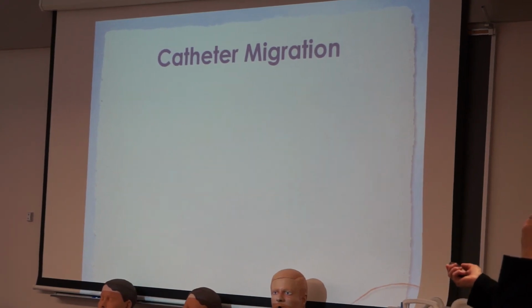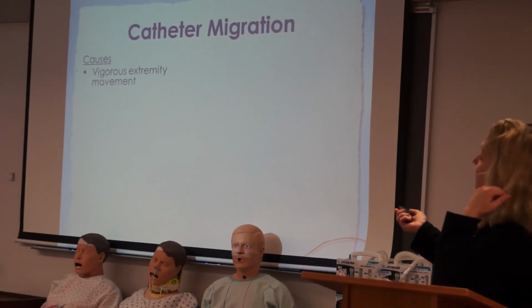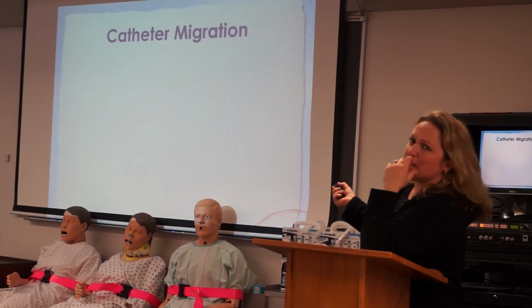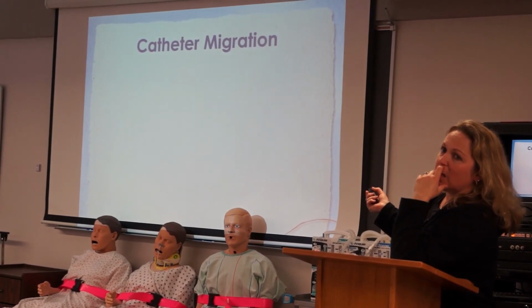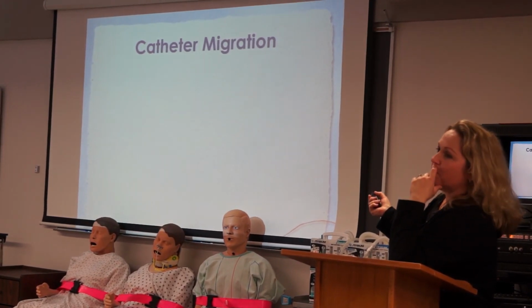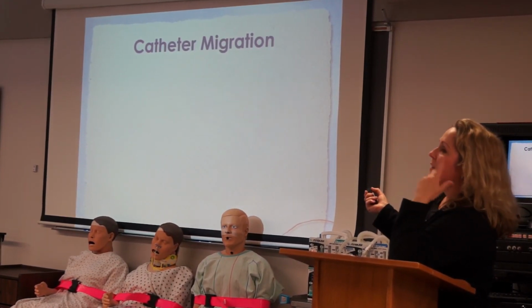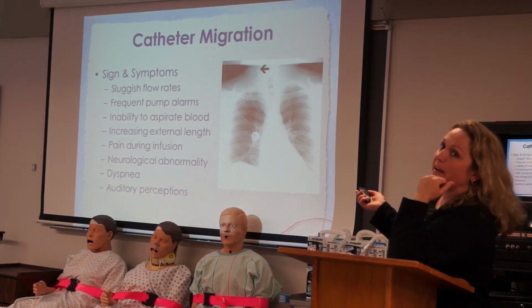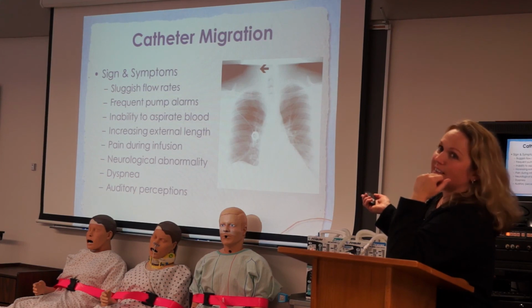Did you talk about the auditory stuff? I don't know anything about auditory stuff. What is that? If it migrates up this way, you hear swishing, a motion sound. They'll keep telling you there's water running, if it's up in the neck. Say, somebody, the toilet's running or whatever. You hear water.